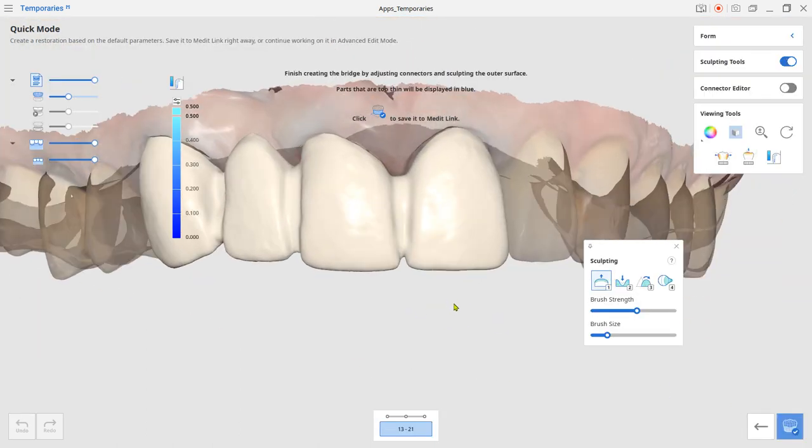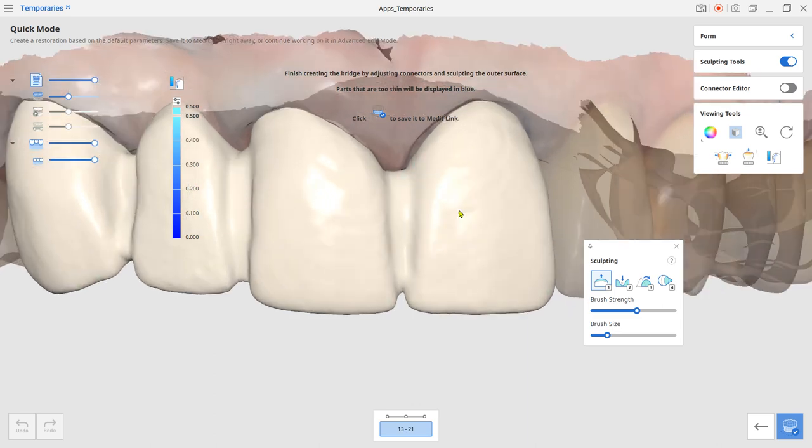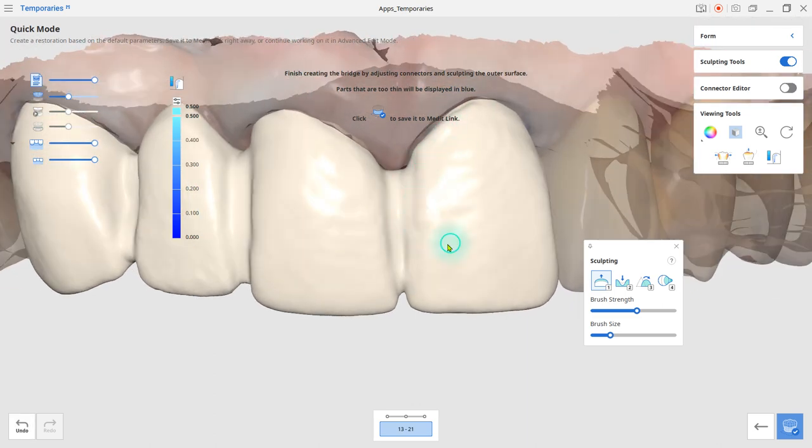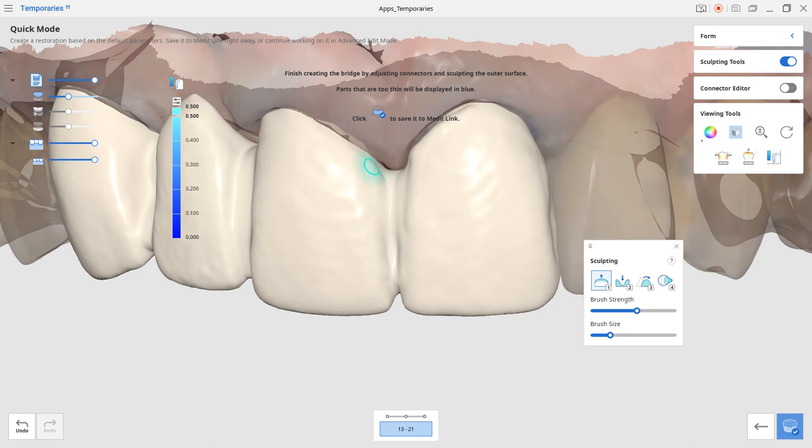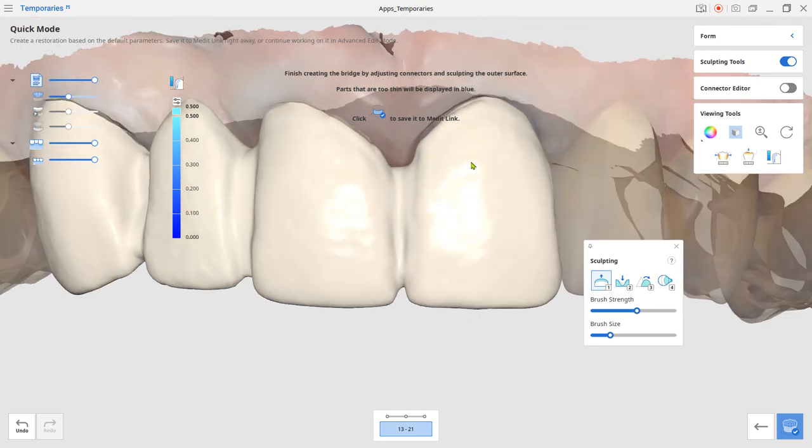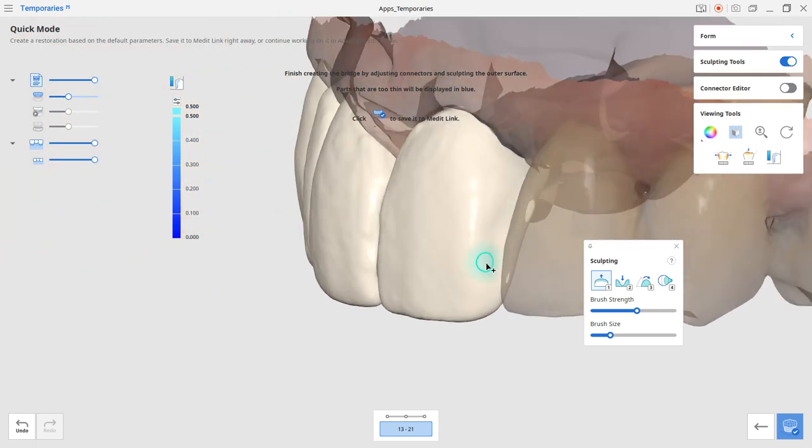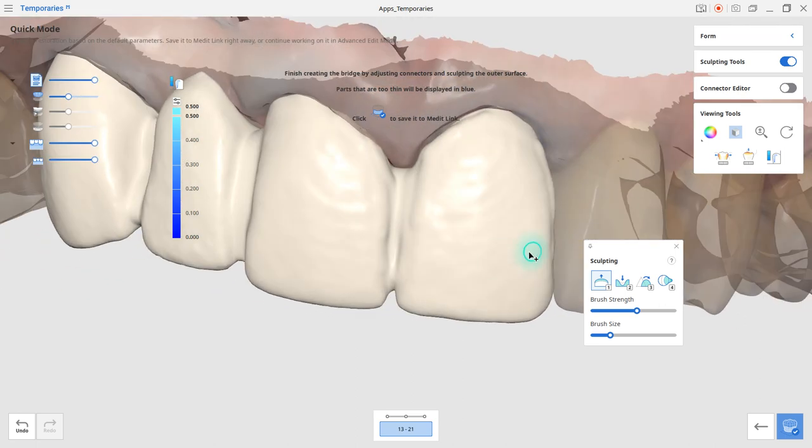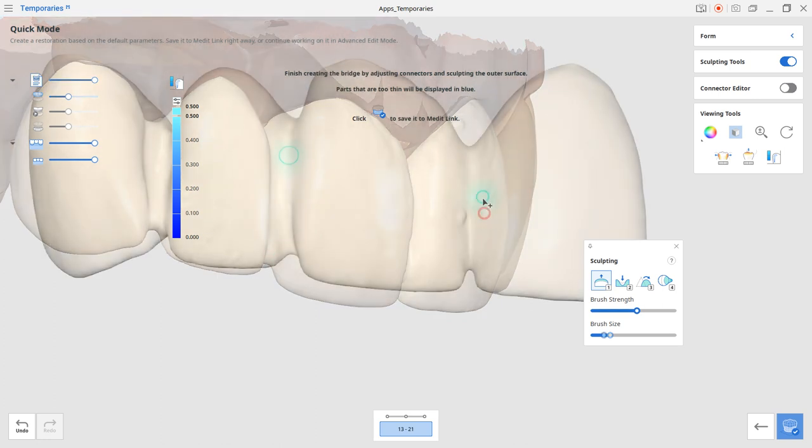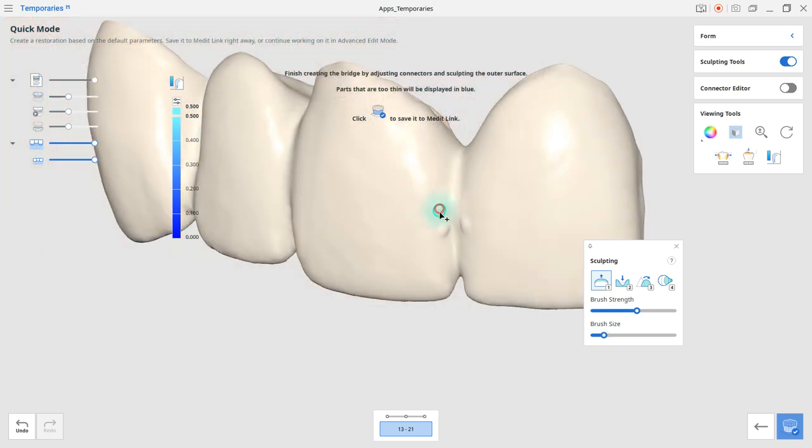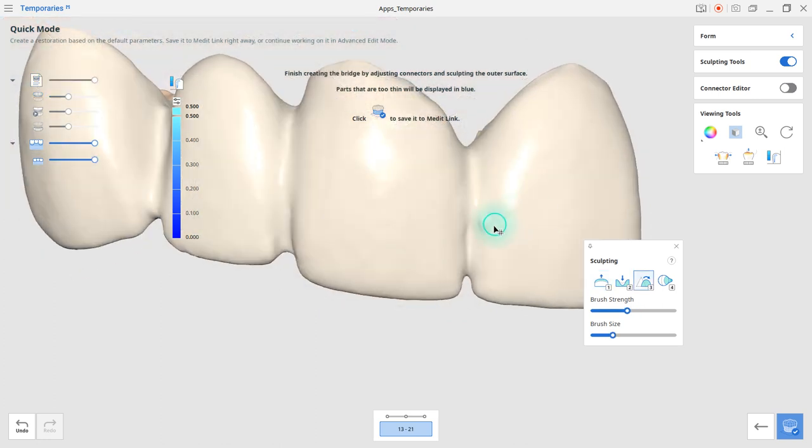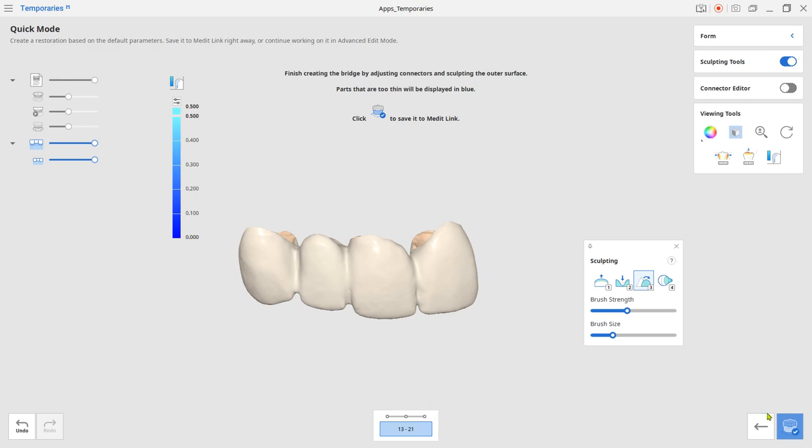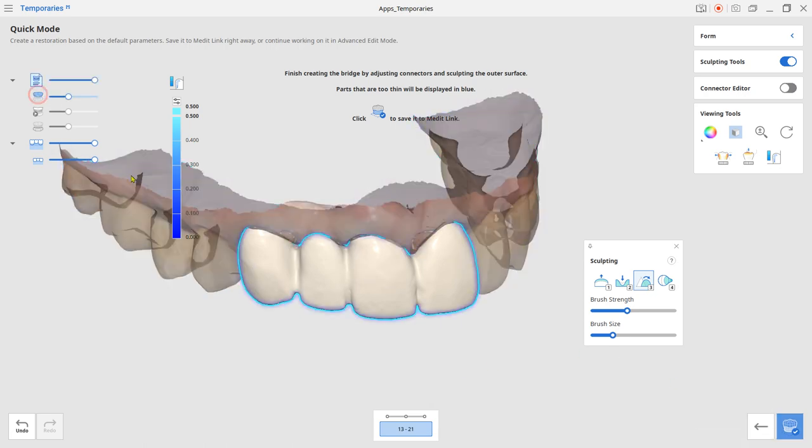Next, perform the exterior shape adjustment if needed. Review the temporary design and click complete to save it.